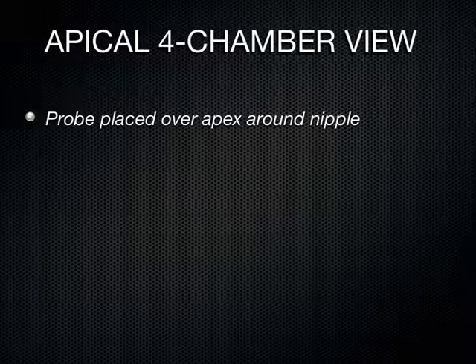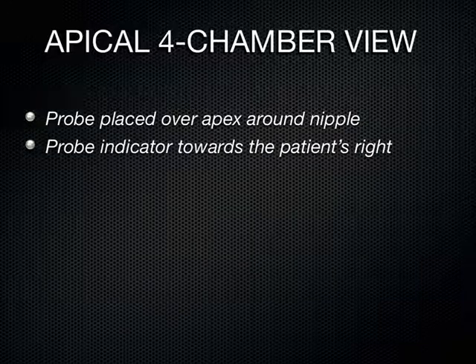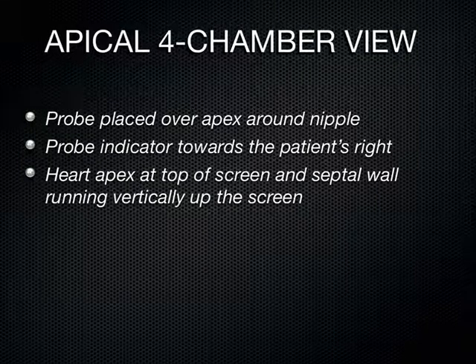It's particularly difficult in women with large breasts because you have to move their breast out of the way to get to this little view here. So this is one you're going to struggle with to obtain, but it's the one that gives you the most bang for your buck. You're going to place that transducer just inferior to where the nipple line is and lateral in that area down there by the nipple. And you're going to have the indicator to the patient's right.